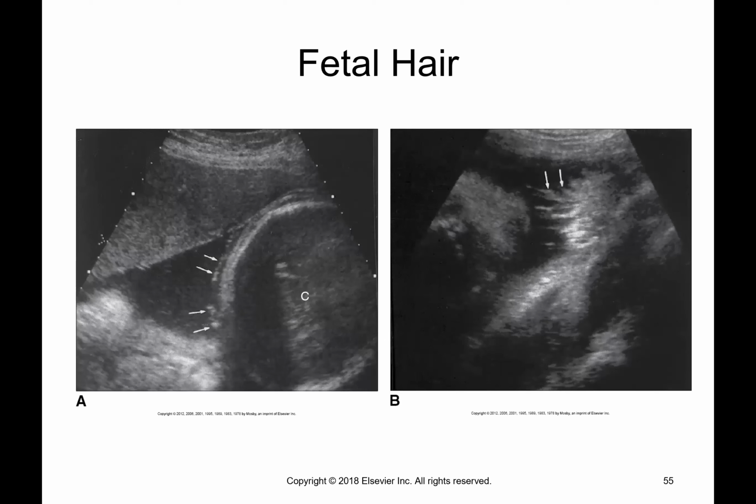Yes, you can also see hair. That's something that I like to show the patients, if I can get a good look. The little white spikies coming off the cranium is hair.